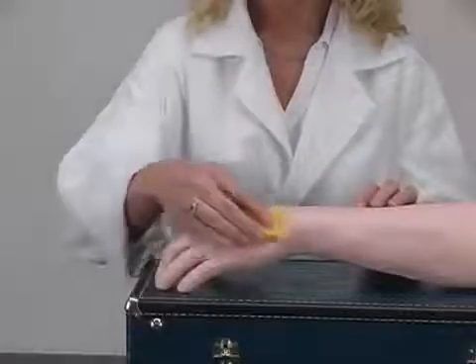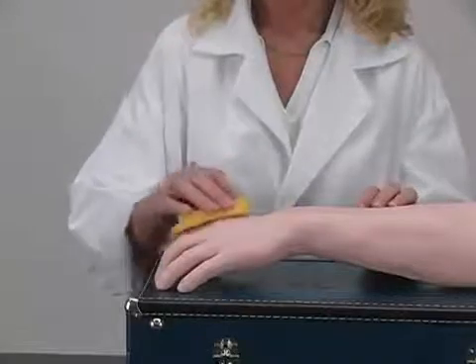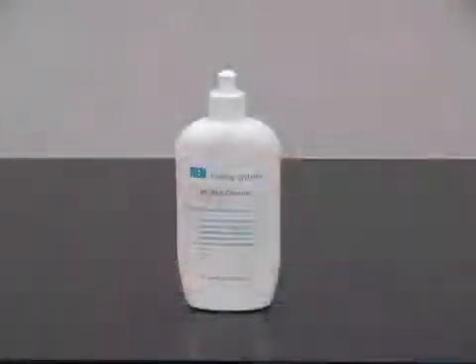If there are any stains on the arm skin, wipe the arm with soap and water. For more difficult stains, use our NASCO Ren Cleaner, which is sold separately.